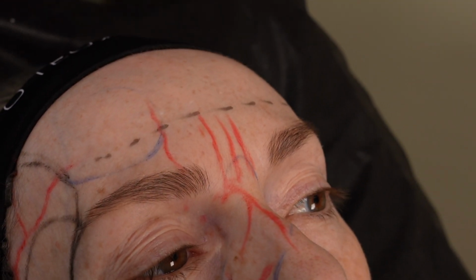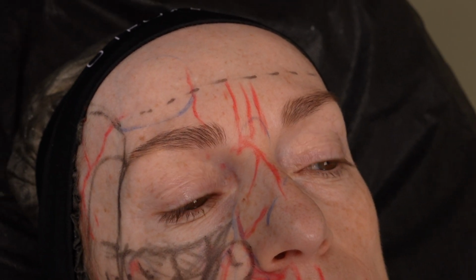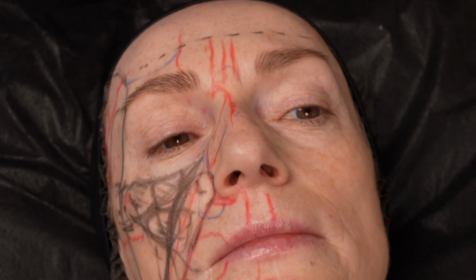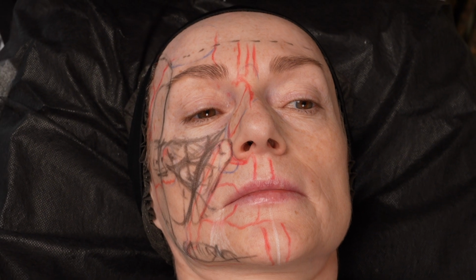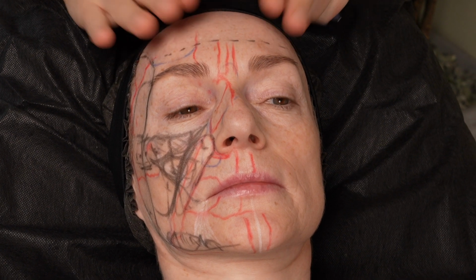But when I touch the bone, then bevel down, with the opening of the needle just over the bone, then all my dyed hyaluronic acid is underneath the galea. We tried it in the cadaver. So that's really important for head injections when you do it with the needle.